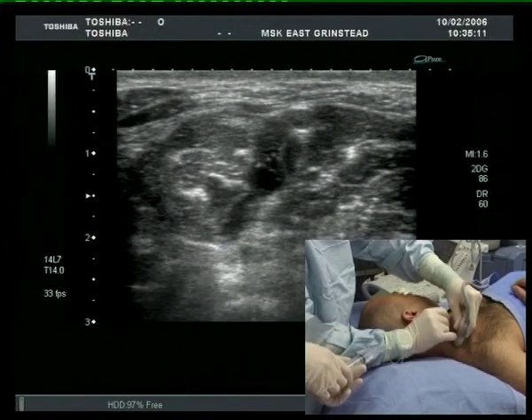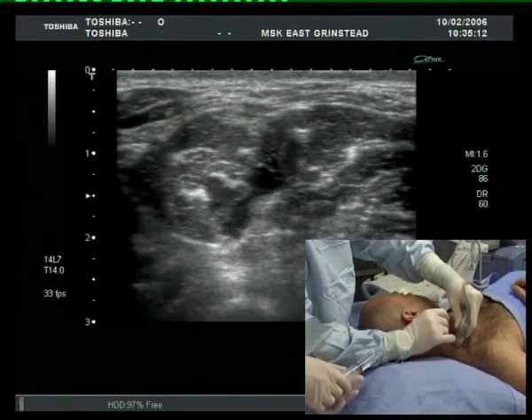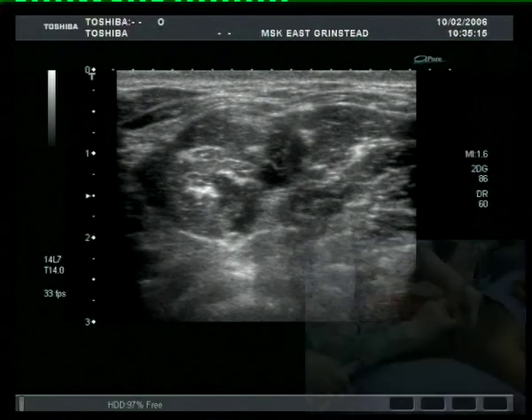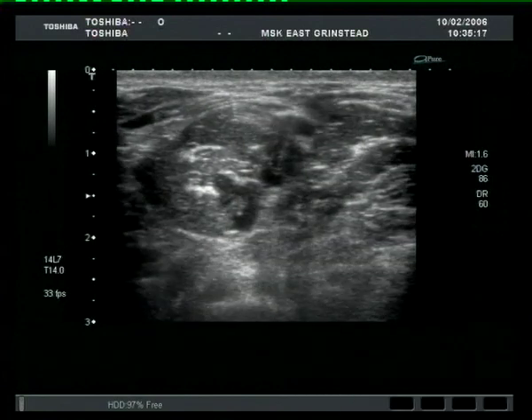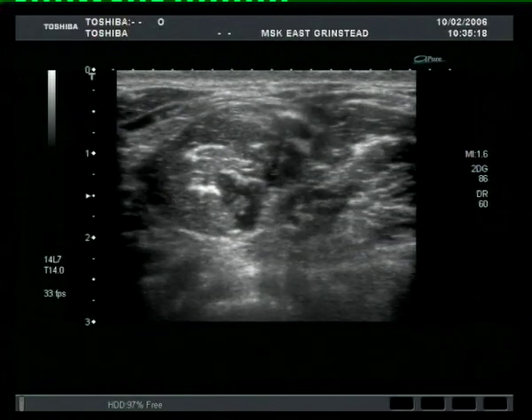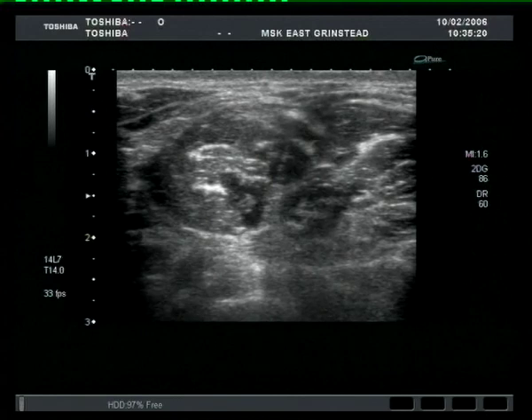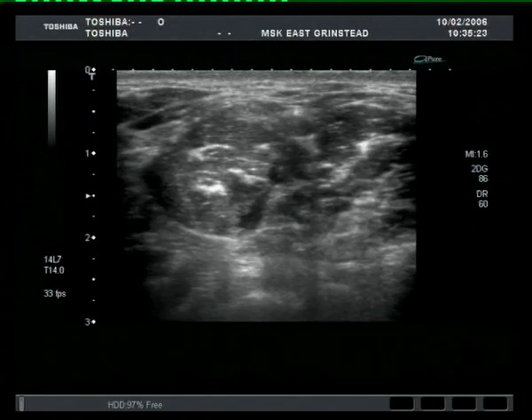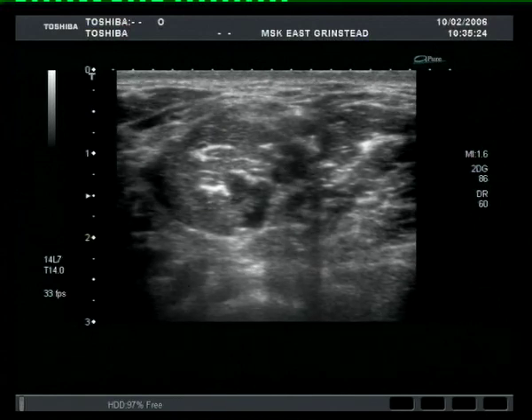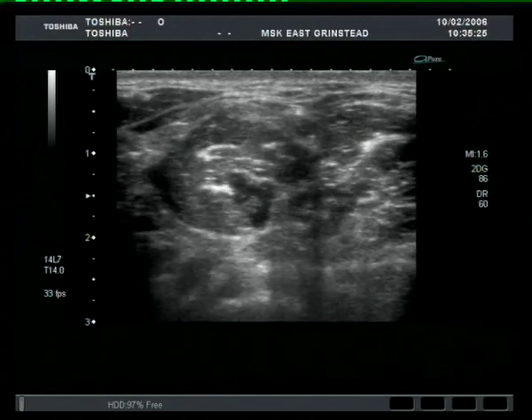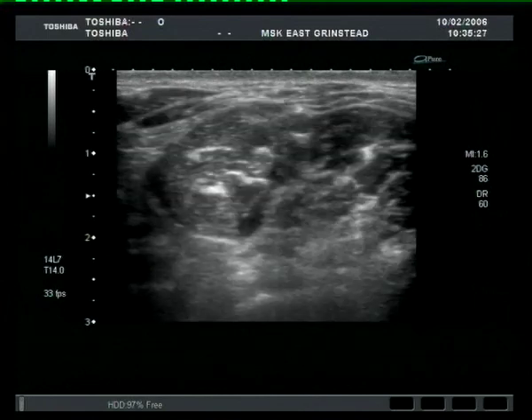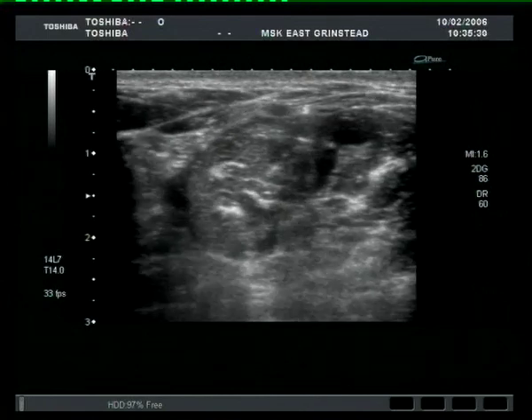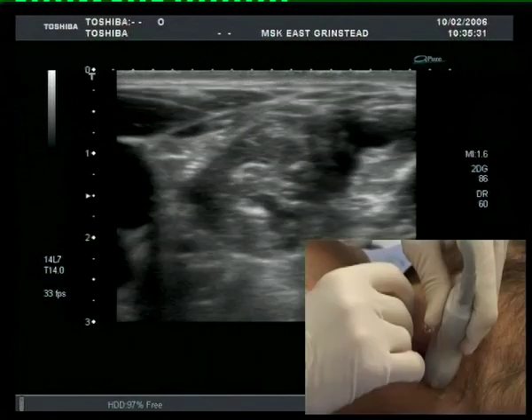The needle is then withdrawn to just underneath the skin and redirected towards the posterior aspect of the roots. Injecting a further 4 to 5 mls generates spread over the posterior aspect of the plexus.